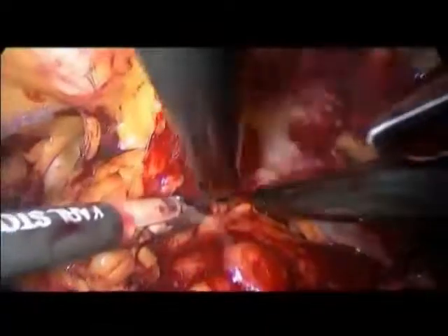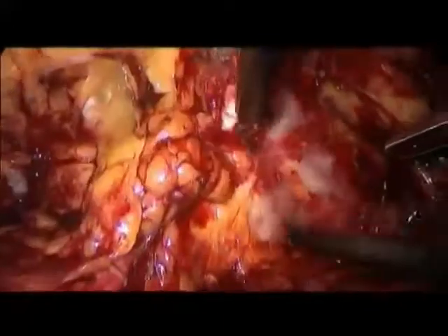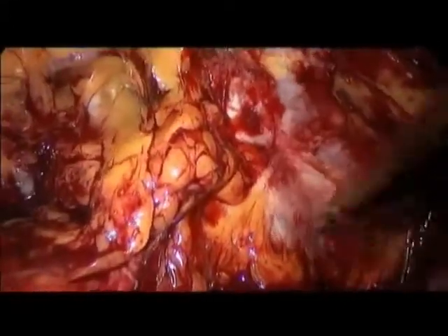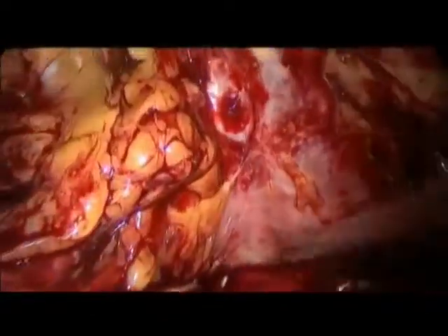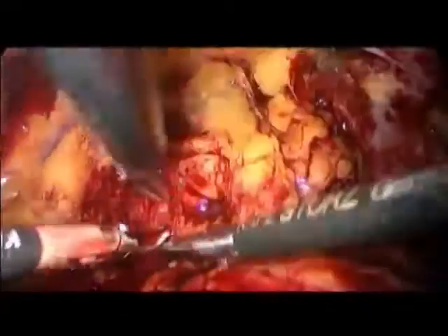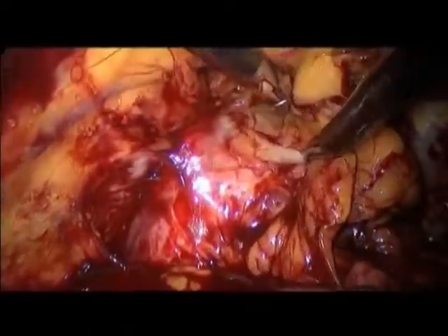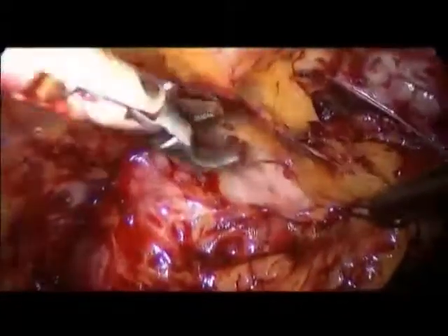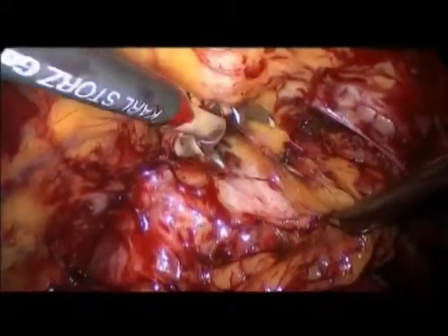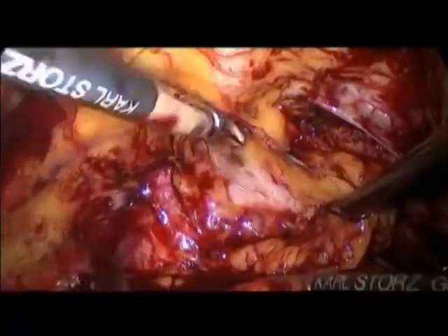We are already here on the right side at the level of the endopelvic fascia, covering the levator and the lateral aspect of the prostate. And we will do the symmetrical maneuver on the left, so that we will remain on the midline with the fat covering of the anterior aspect of the prostate, containing the superficial dorsal vein. We have here a prominent symphysis which can be troublesome sometimes, but I hope it won't disturb us too much.